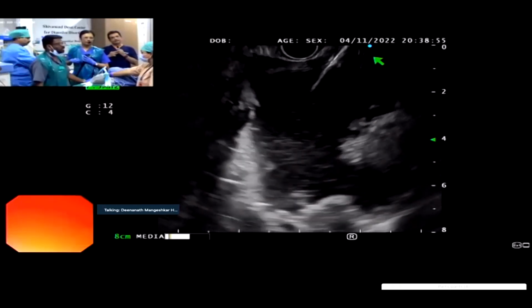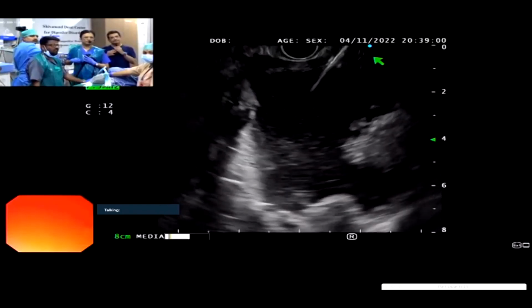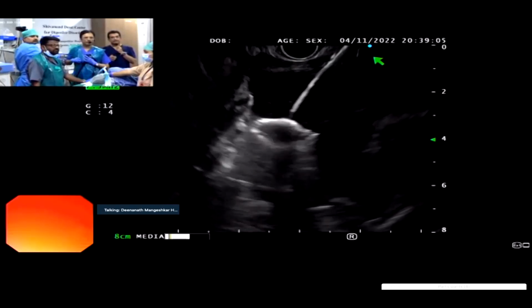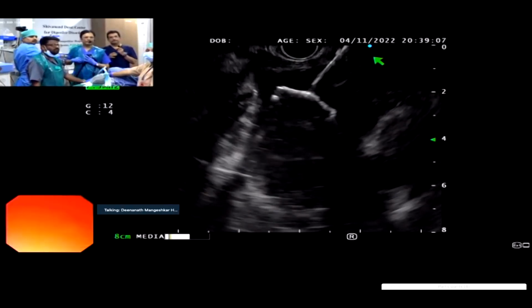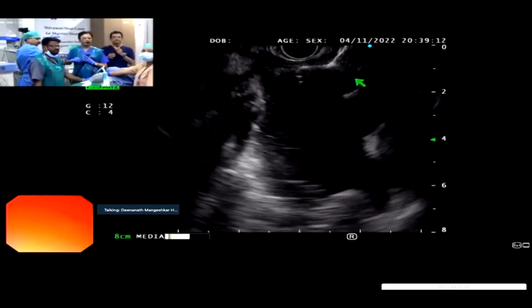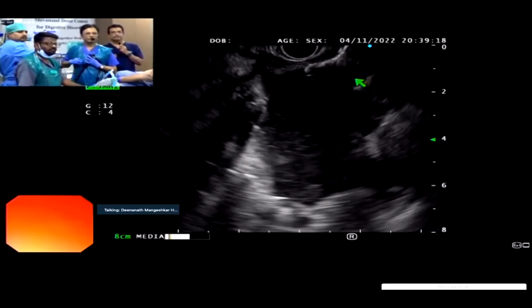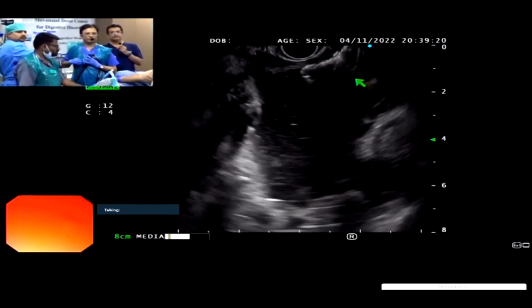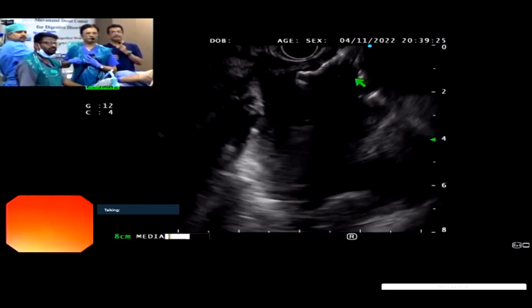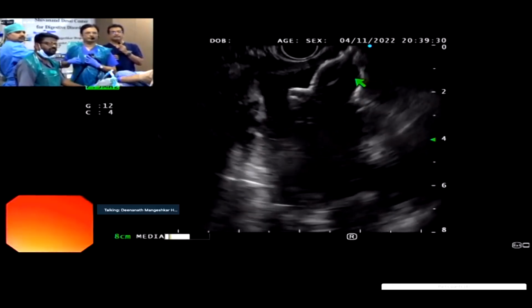So I have already passed the stent inside now. Now I am going to deploy the distal end. Till now I haven't used any endoscopic view or any fluoro. You can see over here, the distal end flange of the stent is opened up. I'm going to pull this here, and I'm going to deploy the proximal end inside the working channel of the scope. He's releasing, retaining the flange against the wall of the collection. So it is deployed now already.